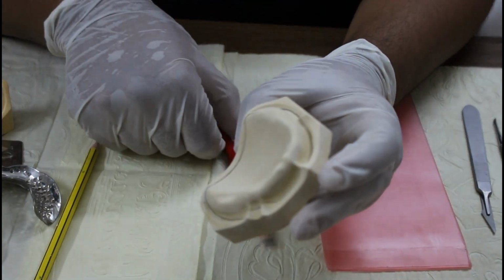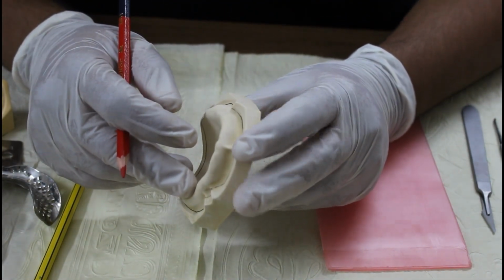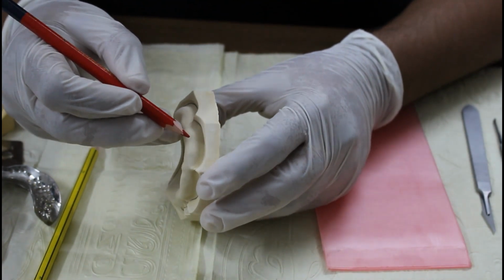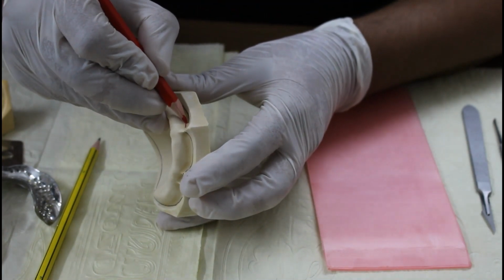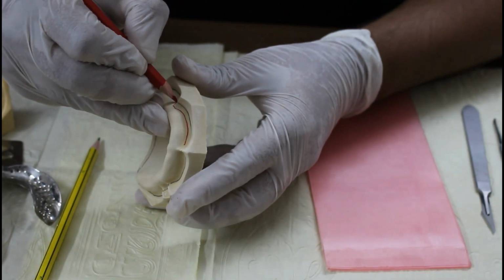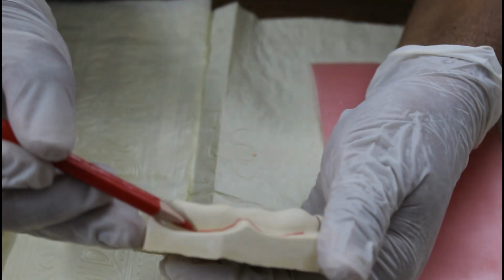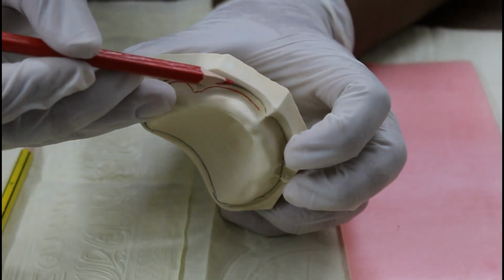Now take a periodontal probe or a ruler and mark one line 2 millimeters above this black line. We take red color and mark a line 2 millimeters above this black color line. See here carefully. We are marking a line 2 millimeters above. Okay, I will show you by drawing it here.